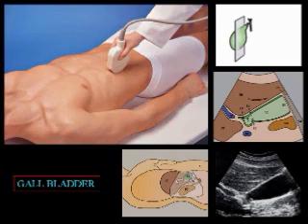Another thing, the same patient. Here, the probe is kept to scan the gallbladder. And the ultrasound beams are cross-secting the gallbladder. And on ultrasound, we can see this is ultrasound of the gallbladder. This is part of the liver. This is gallbladder. The lumen is fluid-filled, so it is not giving rise to any signal. And the wall is slightly echogenic.